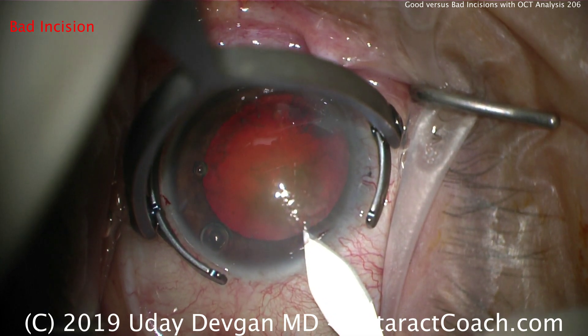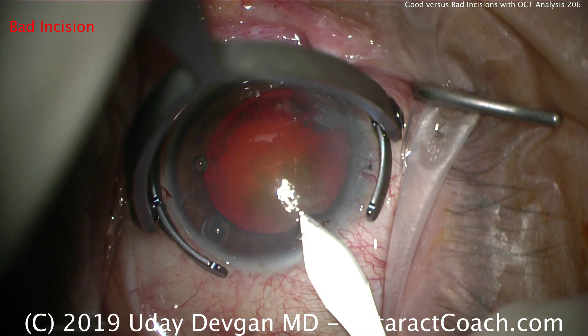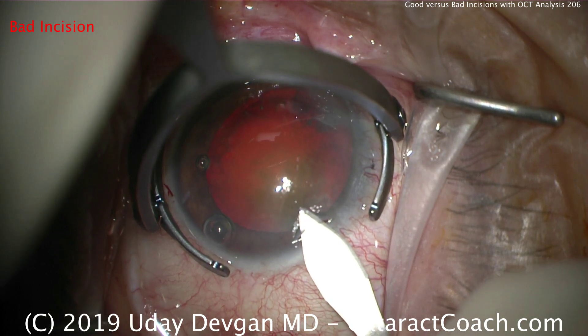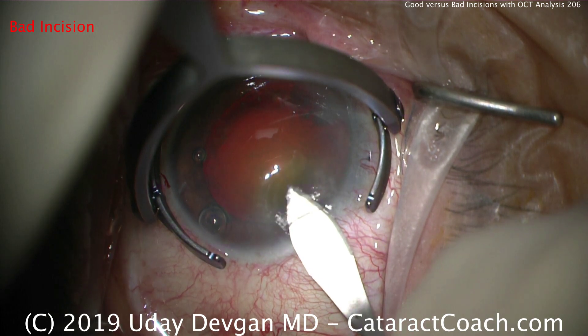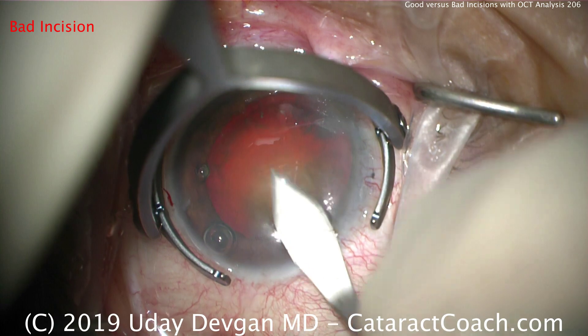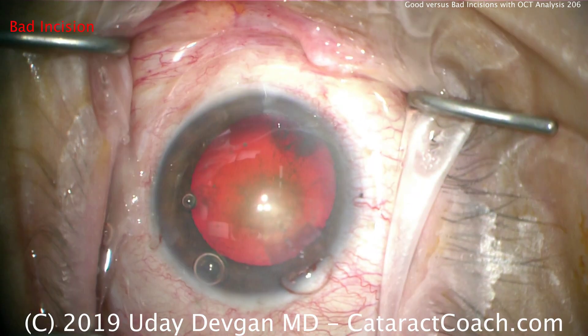The tip of the keratome here should be angled down more, just slightly down. Instead, the resident is advancing the keratome, resulting in a very long tunnel length and a very thin roof. It's getting too long — a very long incision. There's an abrupt change in position before entering the anterior chamber. You can see that's a very long tunnel length.